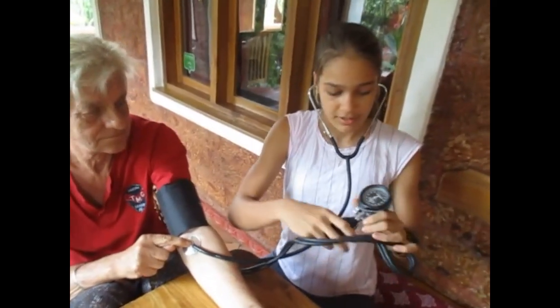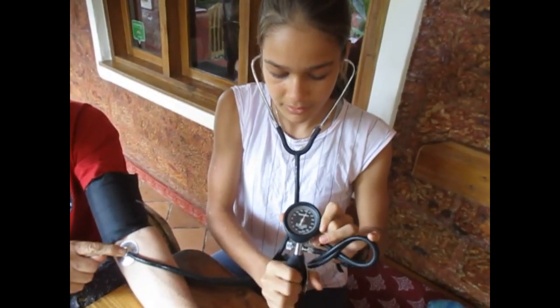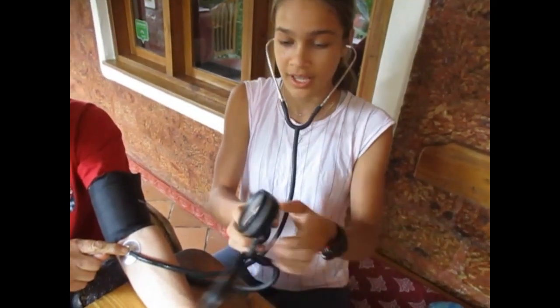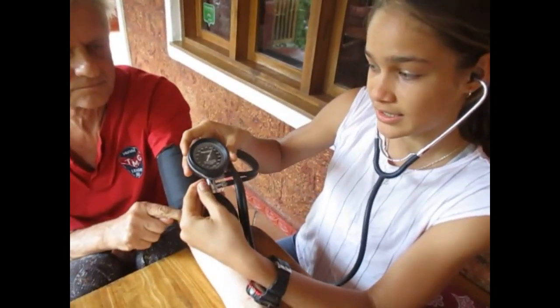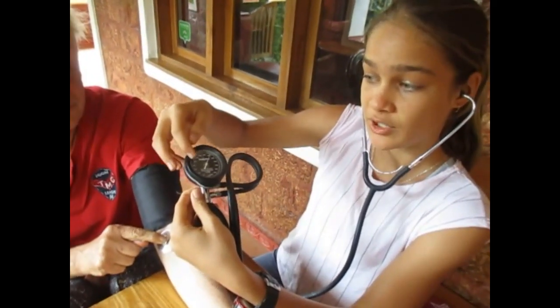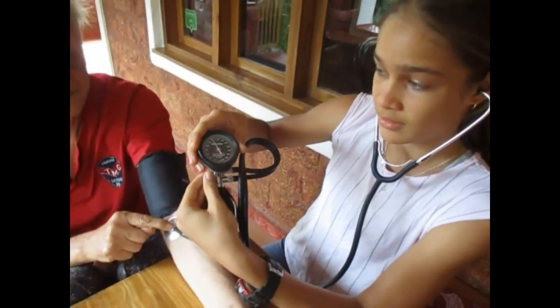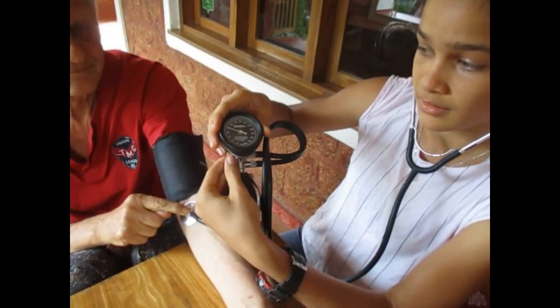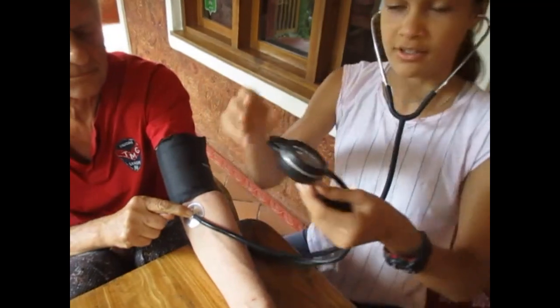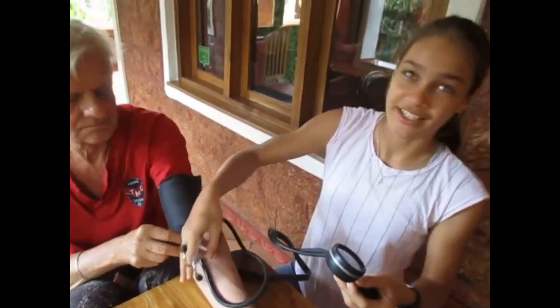Now I'm going to pump it to about 200. Okay, this is 200 now. I'm going to slowly release a bit of air. When you hear the first pulse, that's the first number, and when you hear the last pulse, that's the second number. Okay, so the first pulse was at 150 and the last one was at 80. So he does have a bit of high blood pressure, but that's how you measure it.